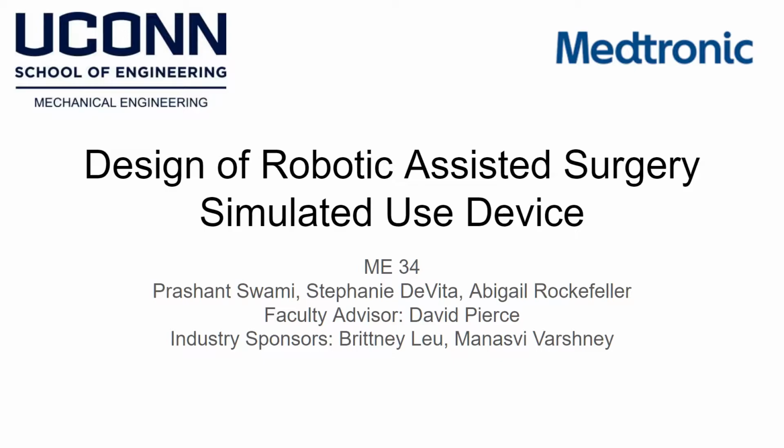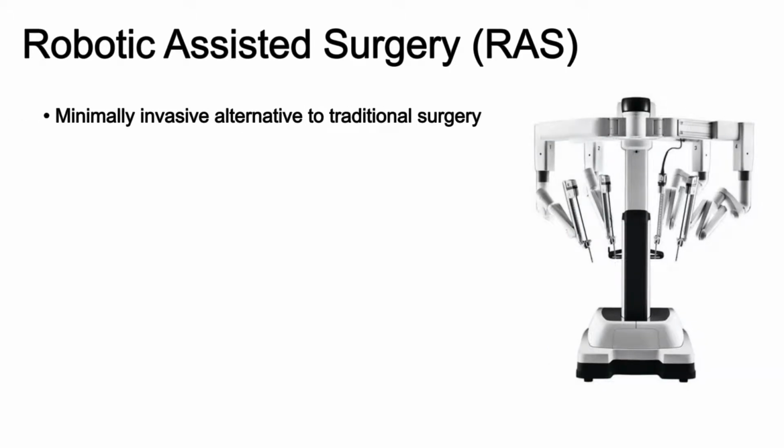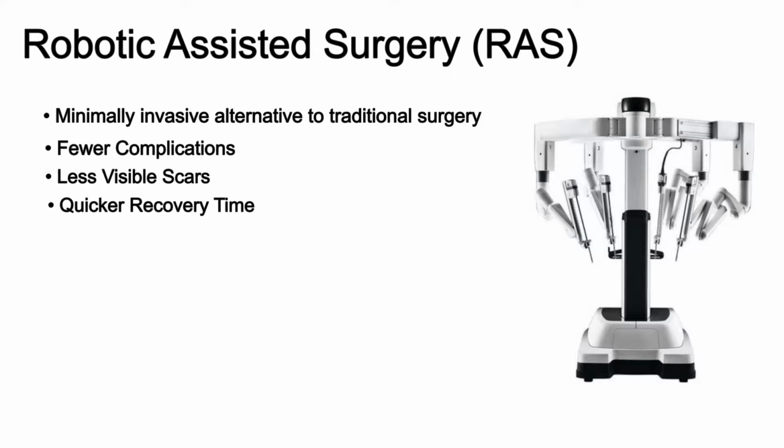We are Team ME34 here to discuss our senior design project, Design of Robotic Assisted Surgery Simulated Use Device. Robotic Assisted Surgery, or RAS, is a minimally invasive alternative to traditional surgery. It leads to fewer complications, less visible scars, and a quicker recovery time.